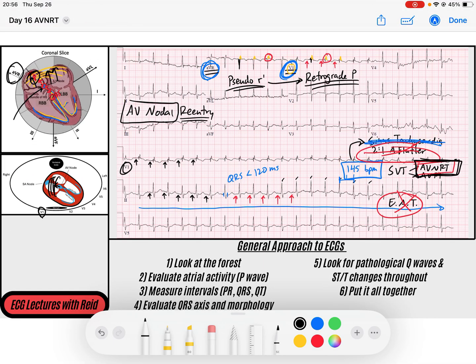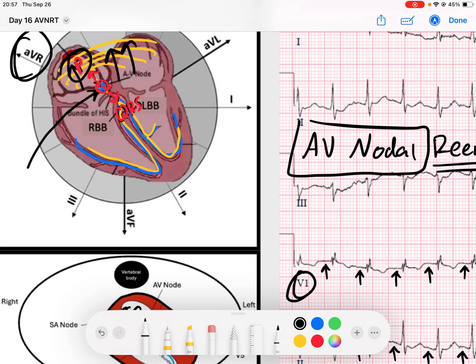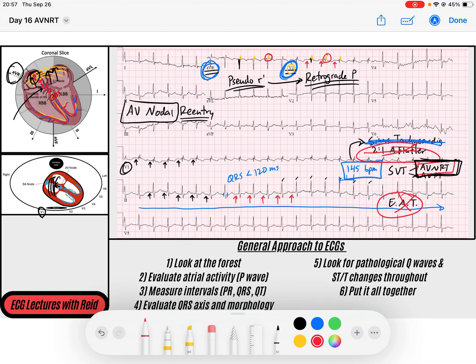This is a great example of AV nodal reentry tachycardia — reentry within the AV node itself, usually initiated by a premature beat. It's a very regular rhythm, most often narrow complex, because the QRS is generated when signals travel down the His-Purkinje system. If someone has a right or left bundle branch block at baseline, they'll have widened QRS complexes — but we don't see that here.